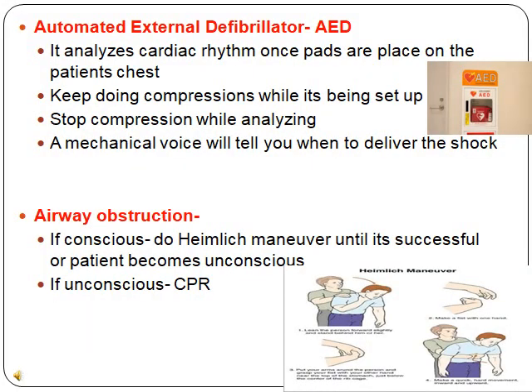AED, an automated external defibrillator. What this does is that you place the pads on the patient's chest and it analyzes the cardiac rhythm. You're going to keep doing compressions while it's being set up, and you're going to stop when it's analyzing the patient, and a mechanical voice will tell you to deliver the shock.